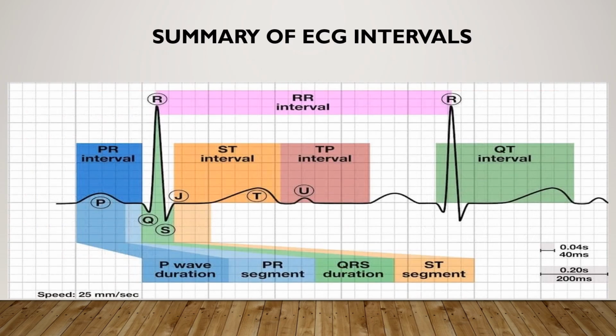And again, let's refresh our memory about different EKG intervals. Let's take a look at this picture and see different waves and different intervals.